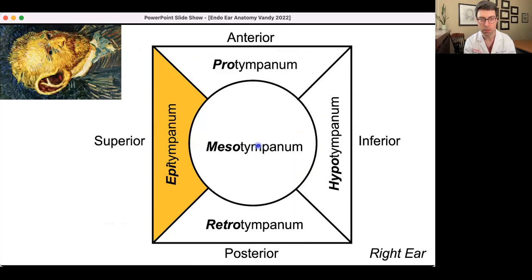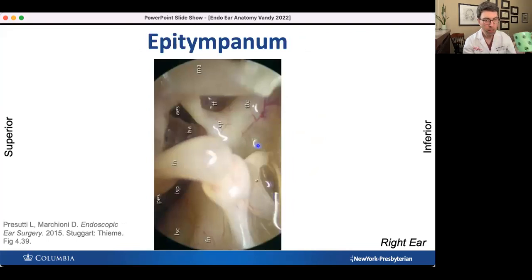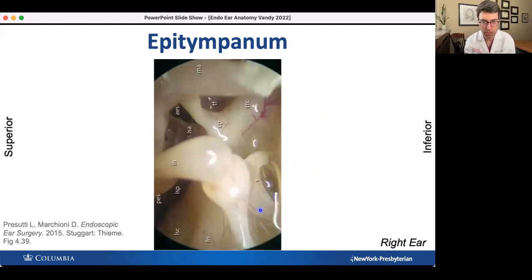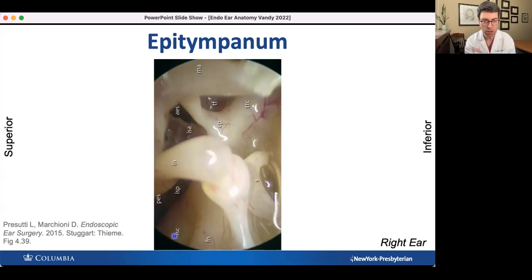Now let's march into the epitympanum — the space just superior to the mesotympanum we've reviewed. Here are a few mesotympanic structures for orientation: the stapes with its anterior and posterior crura, the capitulum or head of the stapes, the stapedial tendon, and the incus. Like a number 11, here's the malleus and incus as parallel structures. Gazing superiorly, we can see the facial nerve and start to see epitympanic structures including the lateral semicircular canal. Lateral canal, facial nerve, and stapes — three parallel structures. We can look anteriorly into the anterior epitympanic space and posteriorly into the posterior epitympanic space.